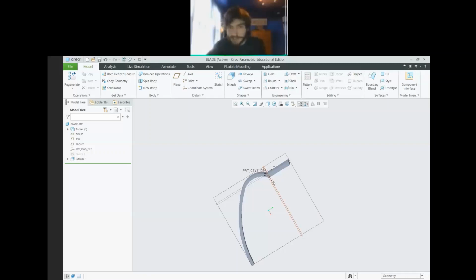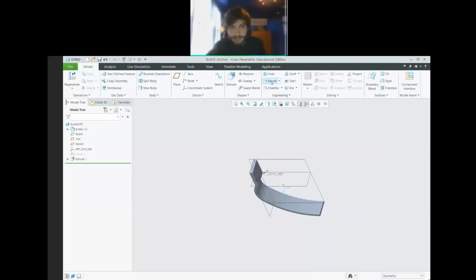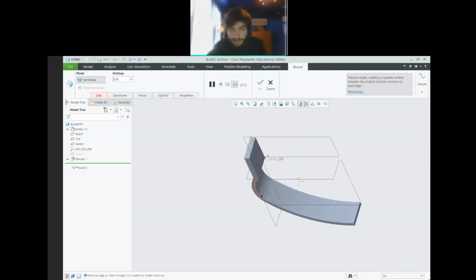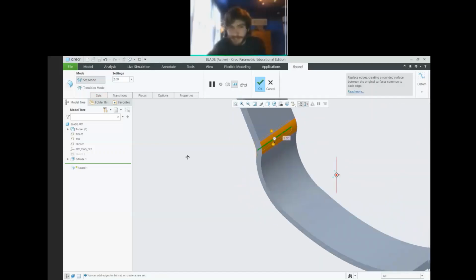Okay, so we'll go back to the default view. So a couple other things, right, we can notice is first, most glaringly, right, there's this sort of round here at the end. So that's quite simple, right? We can go to a round tool. I don't know, maybe it's like 2. Right, we'll click this curve. We'll click the back curve. We can easily go ahead and add our round in.